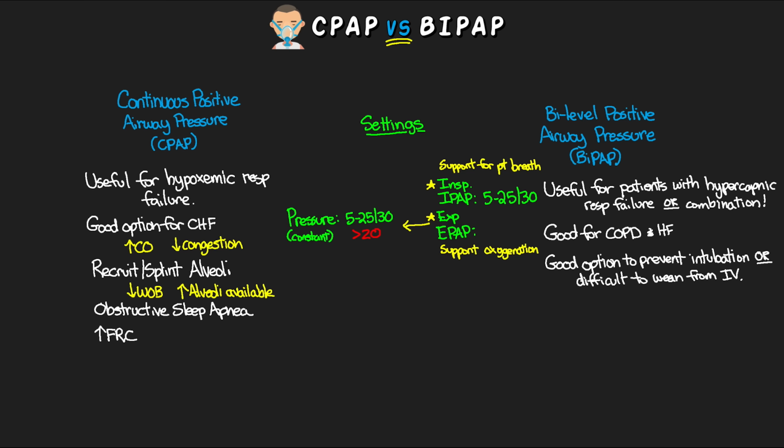Now, we can set our patient's EPAP to 0 if oxygenation is not the problem. The human body naturally has a physiologic PEEP that's about 2 to 3 centimeters of water. And this is a key difference between non-invasive and invasive ventilation: in intubated patients, this is not an option. That's something, again, we'll talk about in a future lesson.